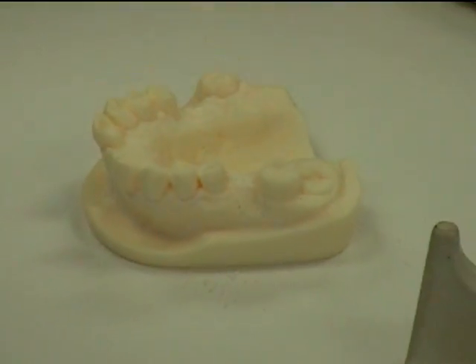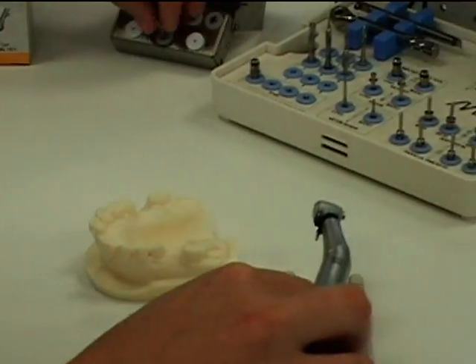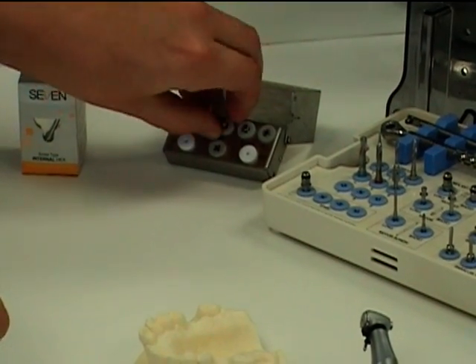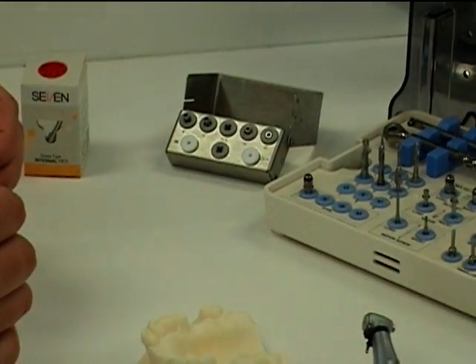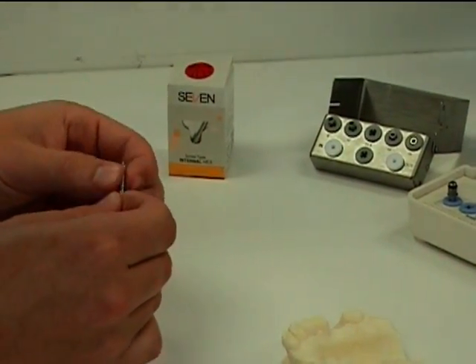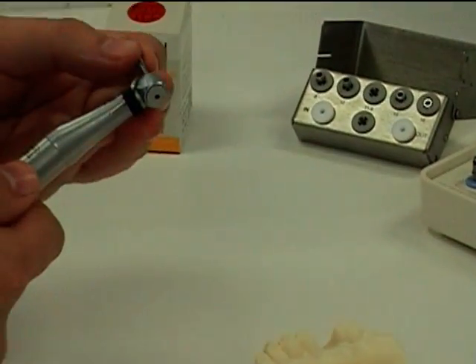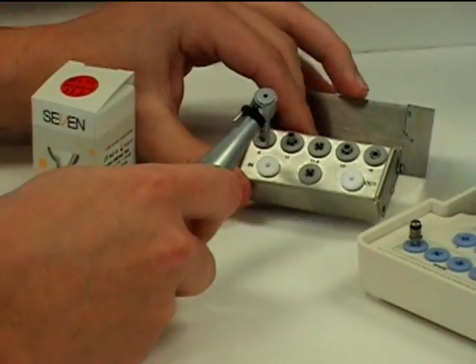Next up, the 2 millimeter drill. I'm going to be using the drill stopper kit, which allows me to control the depth of the drill so that I will not drill too deeply. You can insert it that way, or if you prefer, using the kit itself.